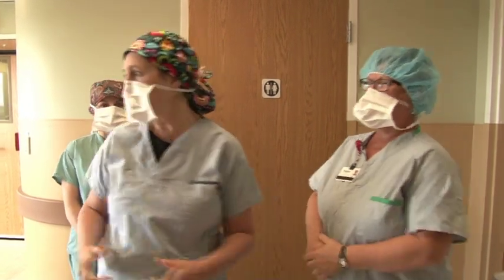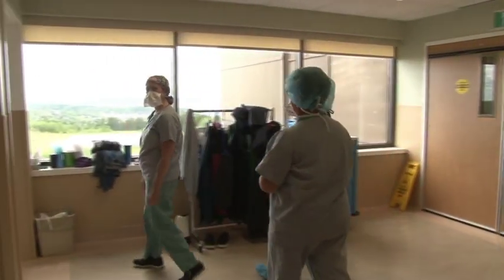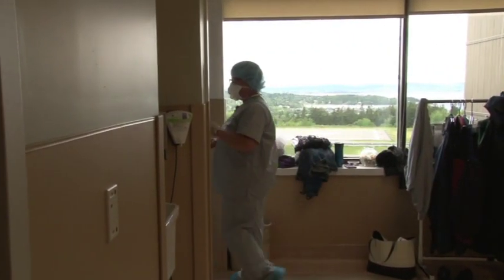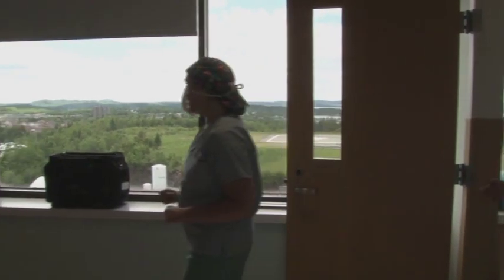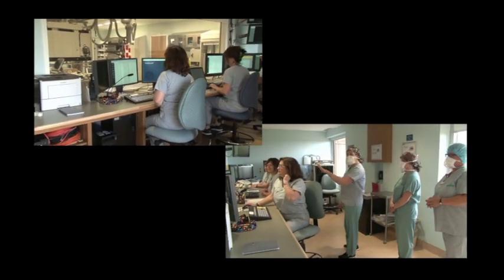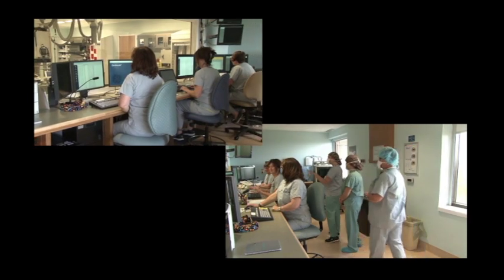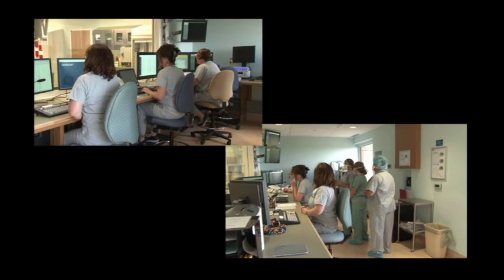Okay. So right around the corner here is our control room. This is beautiful. And right here through the doors. So Sue and Brandy, this is our control room. And on this side to the left is where we keep our photocopier. This is our hemodynamic monitoring. This is where we do our stimulating and ablating. And this is the x-ray side of things, and also when we do our 3D mapping.